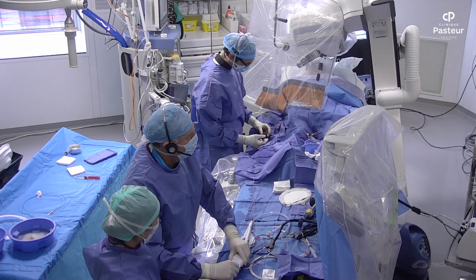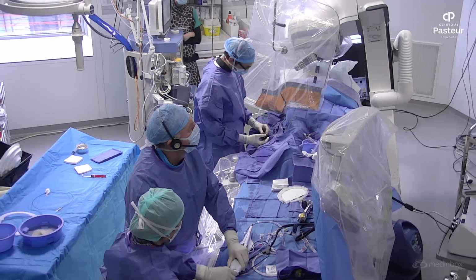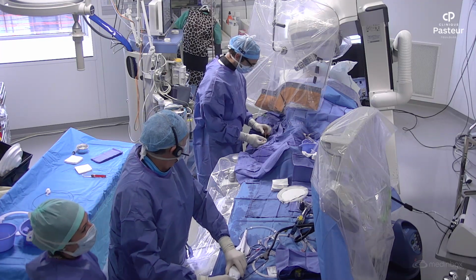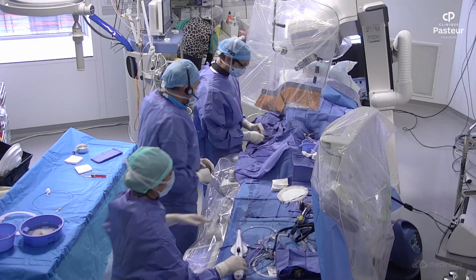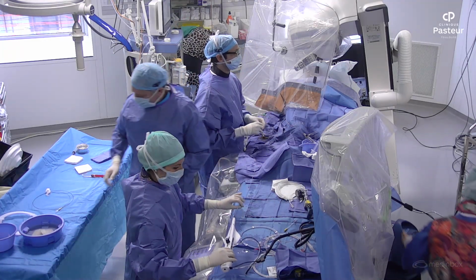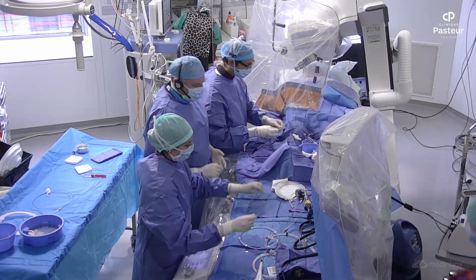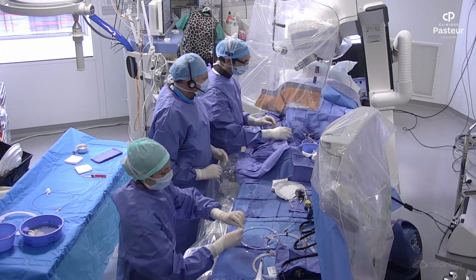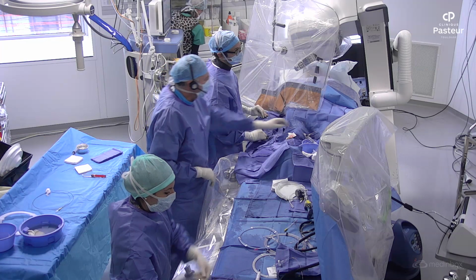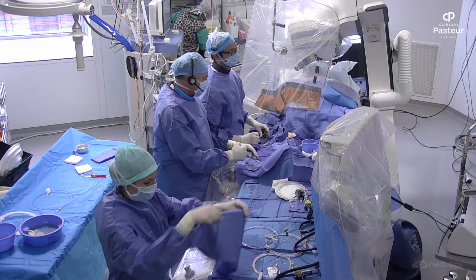That's a very good point, and that's a limit with rotablation, because with the shockwave you can use 2 wires, and so you can protect your diagonal if you want to use the shockwave. That's one of the utility and the safety of the shockwave, and so it's a discussion. But as you say, Flavio, we never see a side branch occluded after the rotablation of the main branch. Yes. There are many questions, so I apologize for making all these questions, but it's nice to have this interaction.